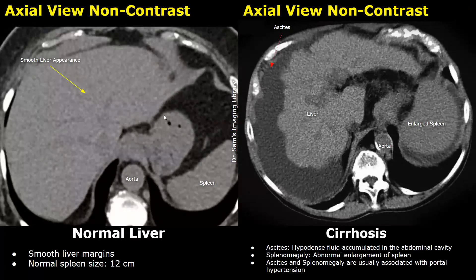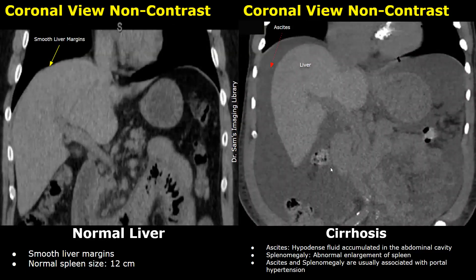This is another case of liver cirrhosis — numerous irregular margins are seen, splenomegaly is present, and there is presence of ascites. This is a non-contrast image. These are non-contrast coronal images — you can compare the appearance of the normal liver with that of cirrhosis. There is a large collection of hypodense fluid surrounding the liver. The surface nodularity is minimal in this case, but this patient did have liver cirrhosis.